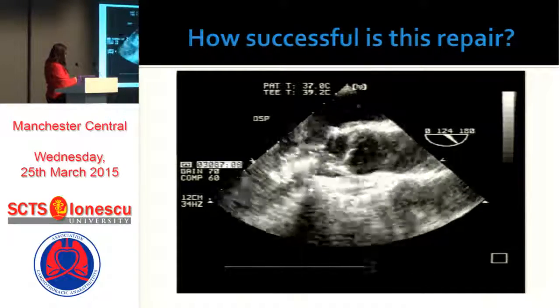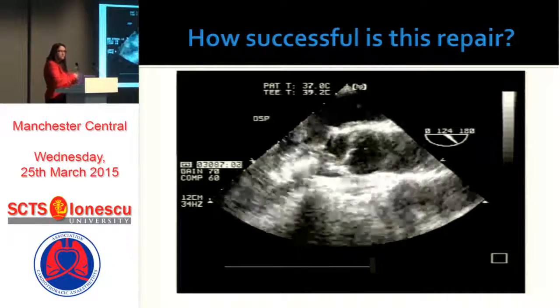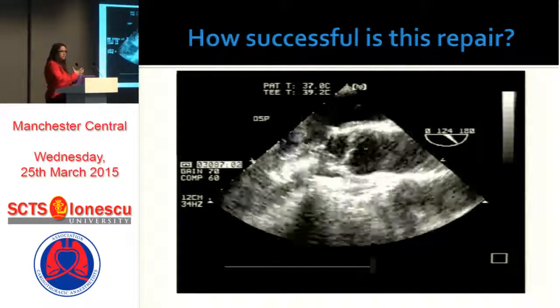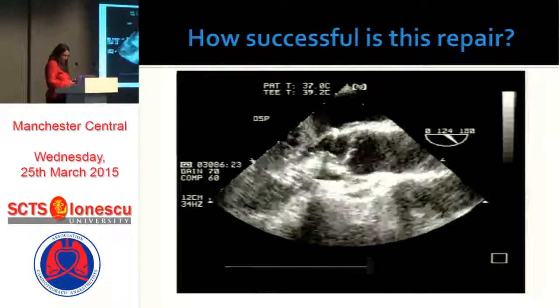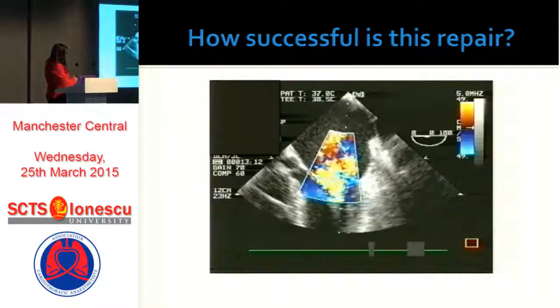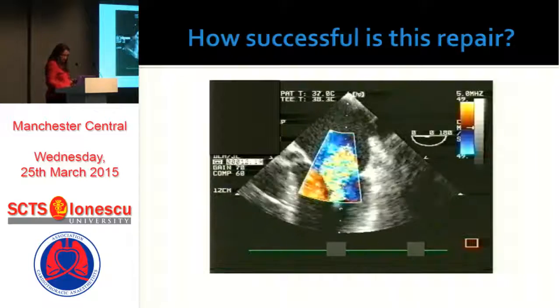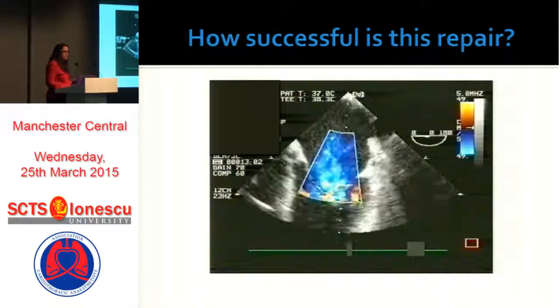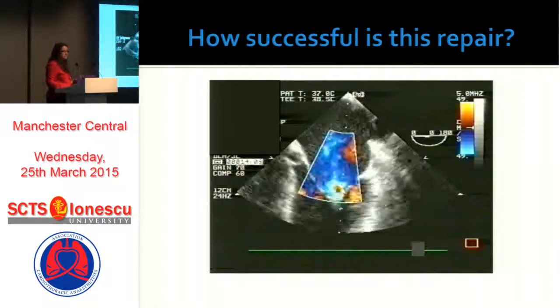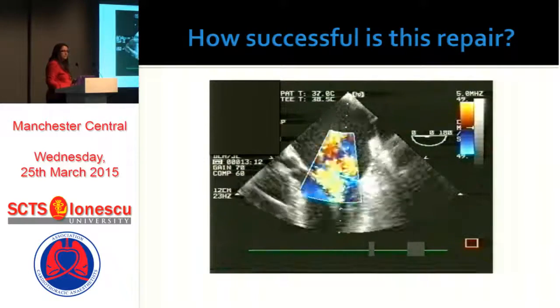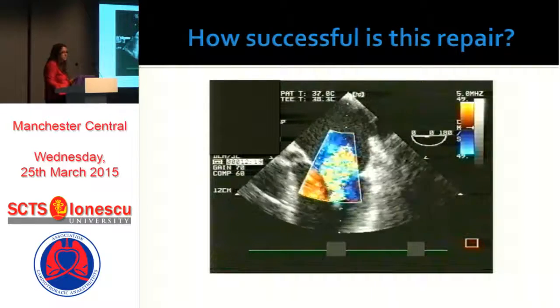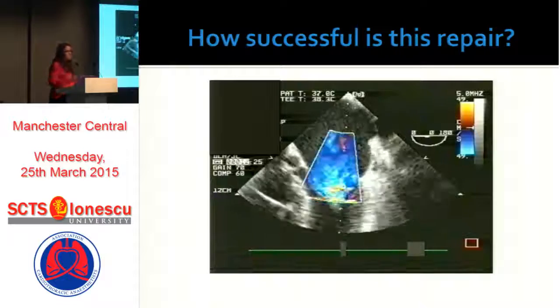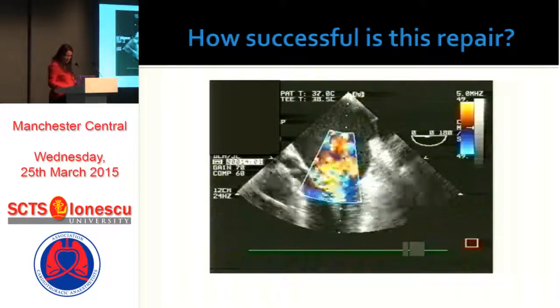SAM like this is not correctable with fluids or reduction of inotropes, but there are functional SAMs where some manipulations can help before going back to theater. What mitral regurgitation would you allow a patient to leave the OR with? The surgeon would like zero to grade two. It's classed as a success in cardiology if you can reduce the patient's MR to less than grade two.